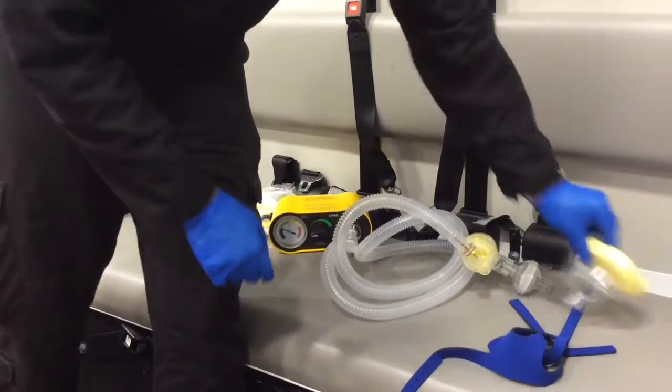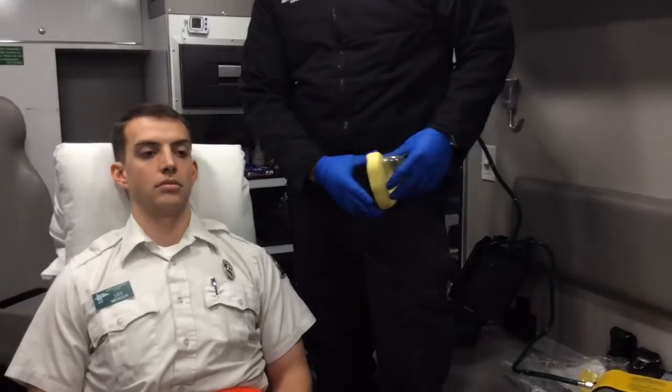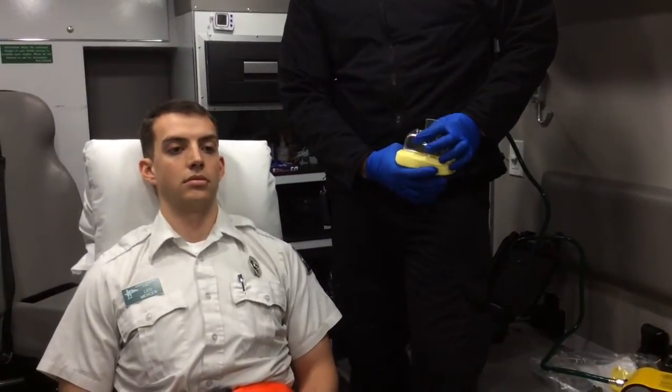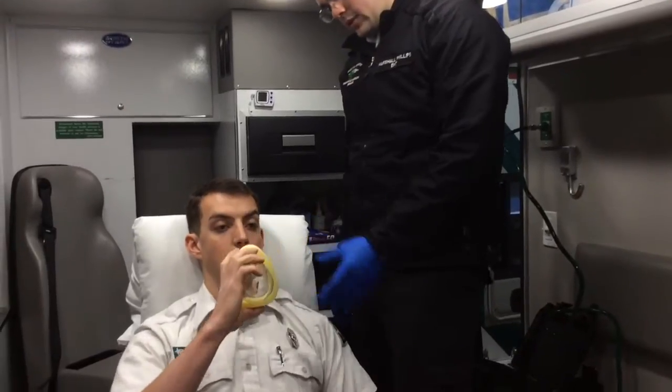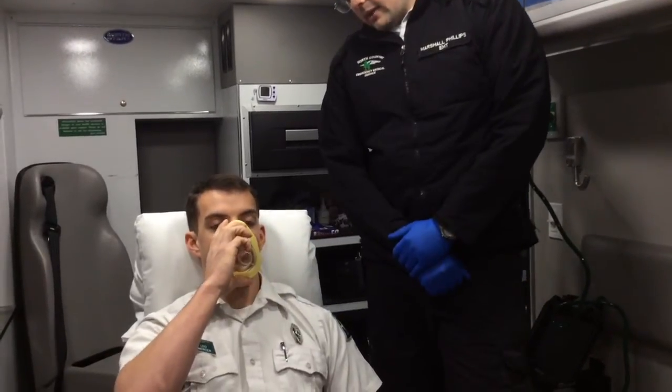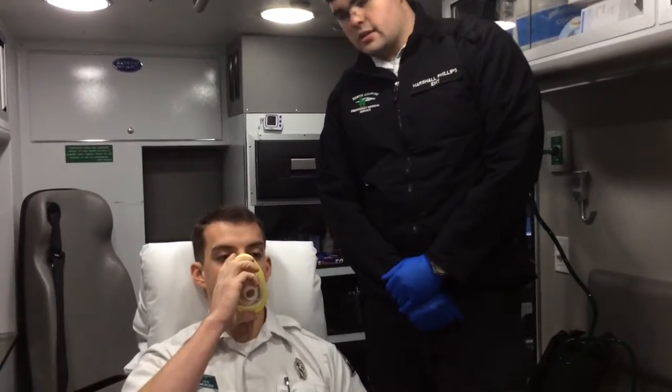We approach our patient. We see if our patient has had CPAP before and if they can tolerate the mask. If they have not had CPAP before, we can give the mask to the patient and ask them to hold it to their face. We ask the patient if they feel comfortable, if they feel claustrophobic, and if they can tolerate the mask.